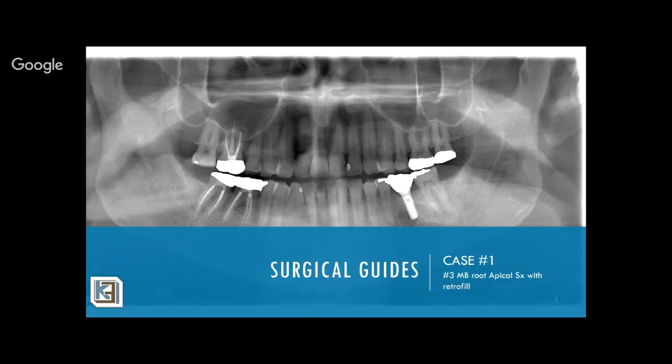Before the Orthophos SL, it was not possible to do endo with the Sirona machines at all. The Orthophos SL has a small field. It's a 5x5. The smallest field on the Carestream is 3x3. And they now have built-in software to eliminate or reduce scatter, almost as good as the Carestream machines.